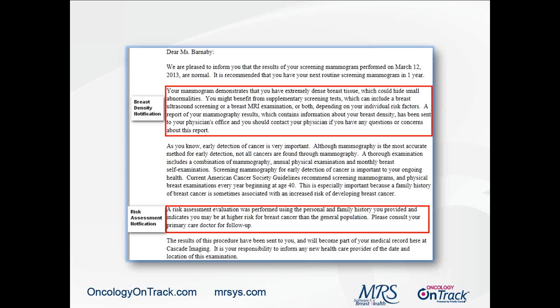Now that the results are in the system, we're ready to send the report to the referring clinician, and we're ready to send the patient her letter. And we know that the letter and the report to the clinician are required by MQSA. You know, this might be the end of the journey for a patient that's negative or benign.